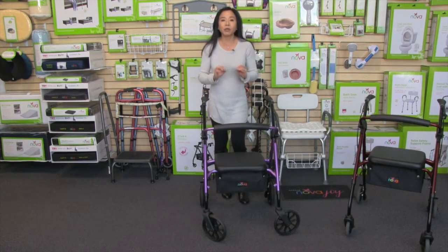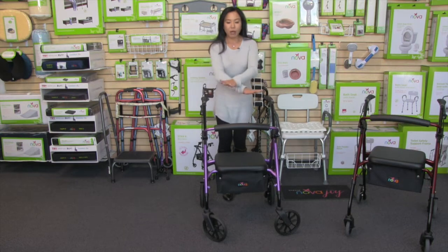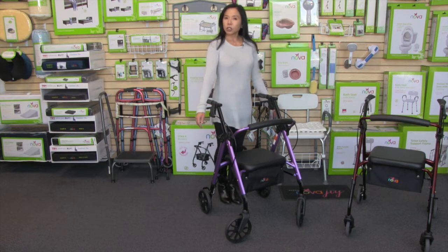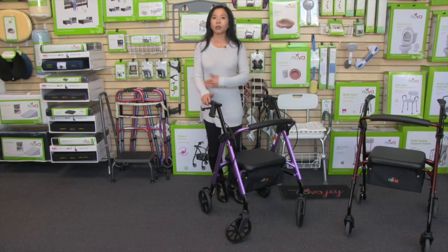And it's really important that you make sure that all 4 legs are the exact same height so you have that perfect stability. All right, now that I've lowered the seat height, I'm going to lower my handle height. So what I recommend is having the handle adjusted to about your wrist. That way when you're walking with good posture, you have about a 30-degree angle.